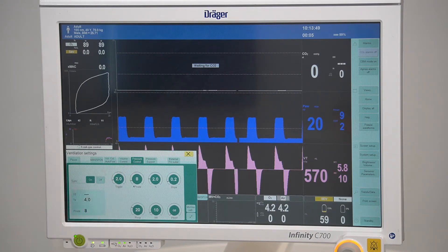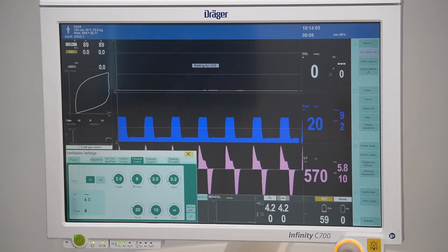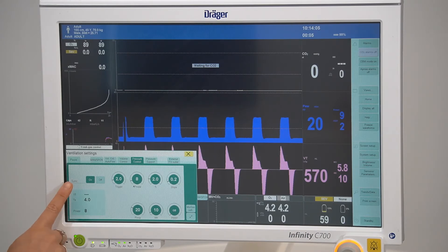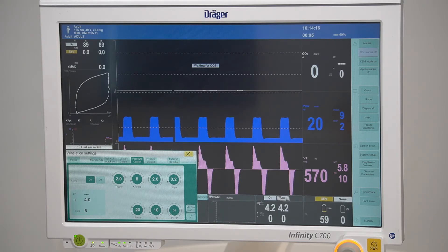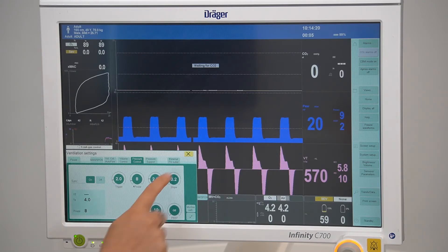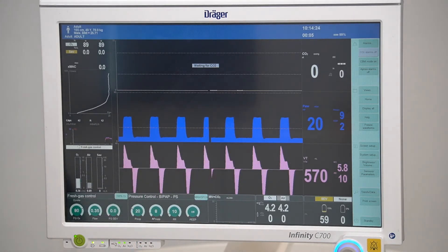Pressure control ventilation switches between two CPAP levels as it enables spontaneous breathing on both pressure levels. Switching sync on will activate synchronization and, if set, activates a set delta pressure support, creating a combination of pressure control and pressure support ventilation. You will also see the term BiPAP displayed in the name of the ventilation mode.